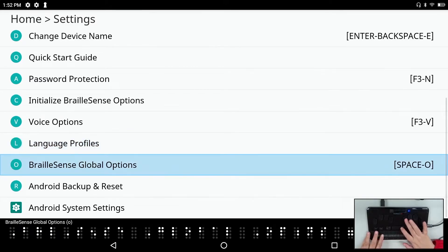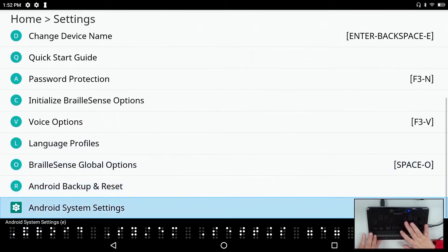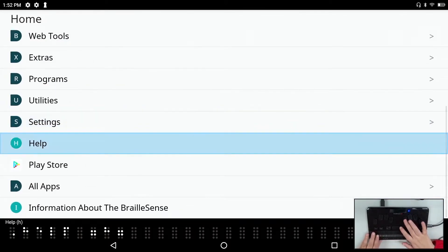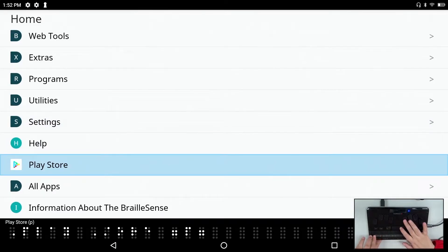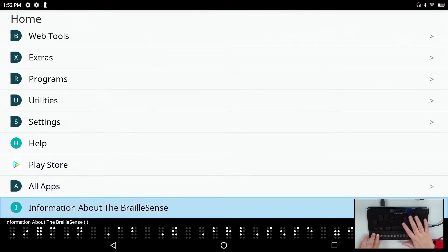We also have BrailleSense global options, Android backup reset, and Android system settings. Rounding out the main menu: help, Play Store, all apps — which contains all installed Android applications — and information about the BrailleSense.